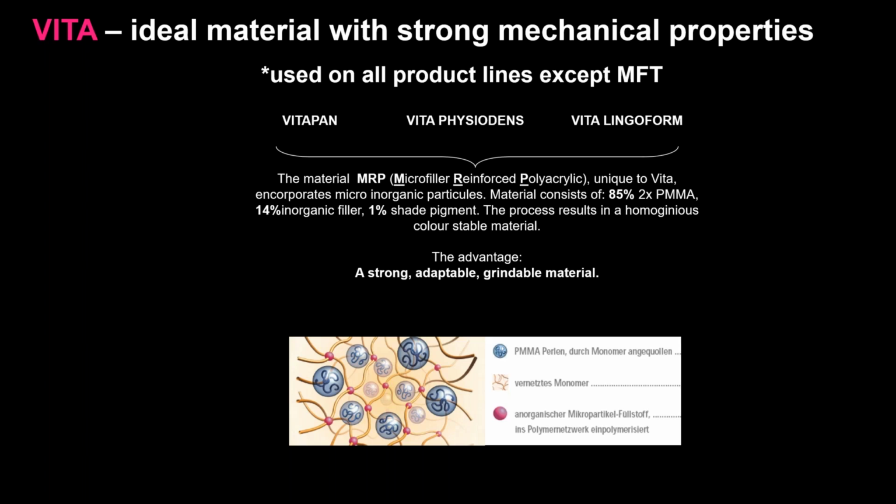It's acrylic glass. Acrylic, you have to polish when you grind. This you don't have to, it self-polishes. So that's a big plus for me, is that I don't internally have to polish any of the cuspals or anything that I touch on the tooth anymore, because it's self-polishing. That's a big one for me now. So it's an acrylic glass tooth, 7 to 10 years of wear life expected on it, and you don't have to polish it. It has the characteristics of enamel.